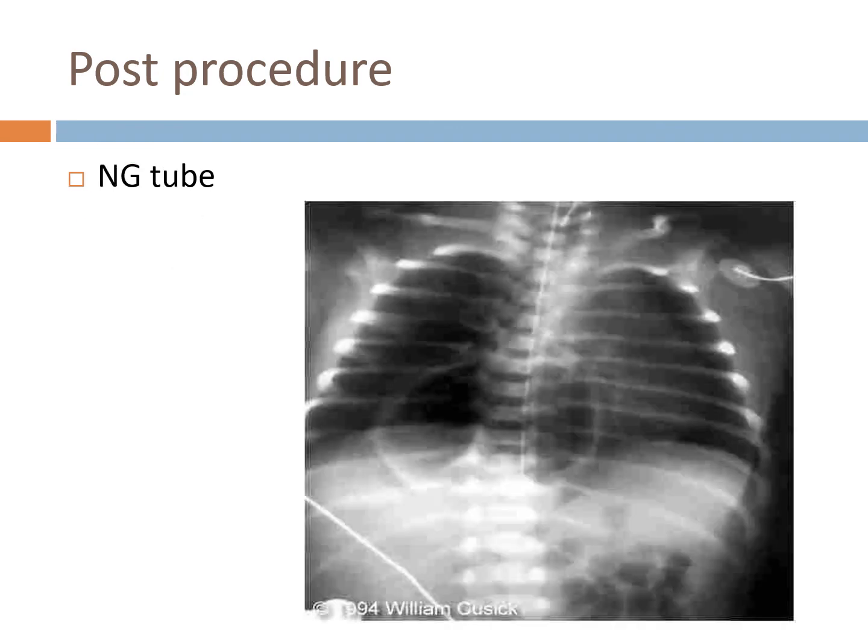Sometimes for an NG tube placement, an AP X-ray is used. A lot of times, if it's a patient that's getting intubated, they'll also put the NG tube in shortly thereafter. Especially if they're a sick patient and deteriorating, we've had to intubate them, and now they put an NG, and now they decide to put a central line in. They'll wait till all that's done, and then they'll just do one X-ray, unless there's some kind of obvious problem.